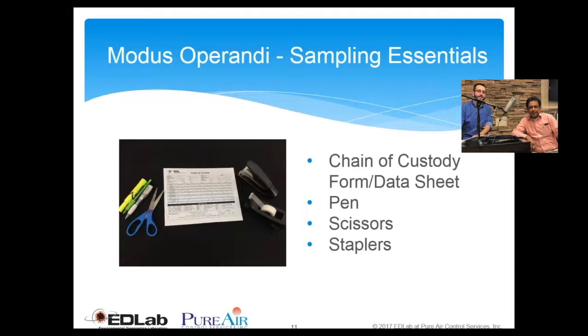Sure. You should be well equipped, because the very first thing is that you should be very clearly demarking or identifying your sample. So we must have a legal custody of the different hands the sample passes through from collecting to the testing in the laboratory. The very first thing I can see of importance is something called a chain of custody. It is nothing but a document which reveals the chronology of the sample: what, when, where, and who has collected the sample. That kind of information is given there.